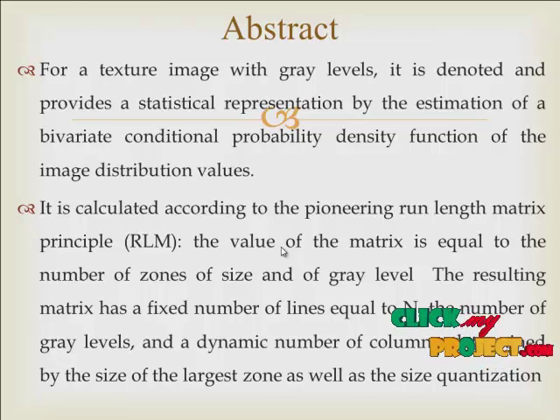Further improvement in accuracy is obtained by application of feature selection using box plot analysis. A set of 61 features is formulated and applied on 192 sections of images taken from 16 patients. Such a classification of malignancies is helpful in prognosis and treatment of oral cancer, which is the most common form of cancer in India.